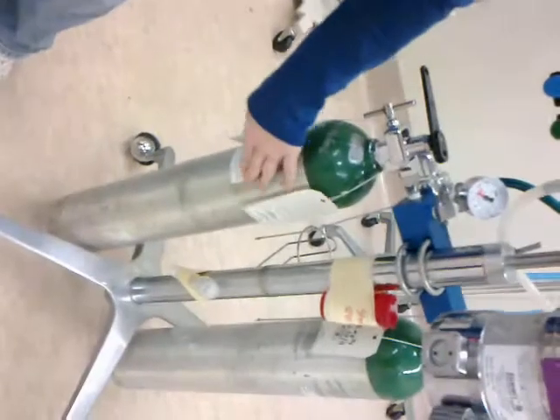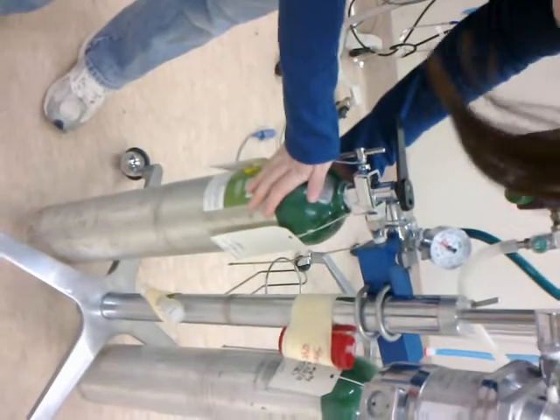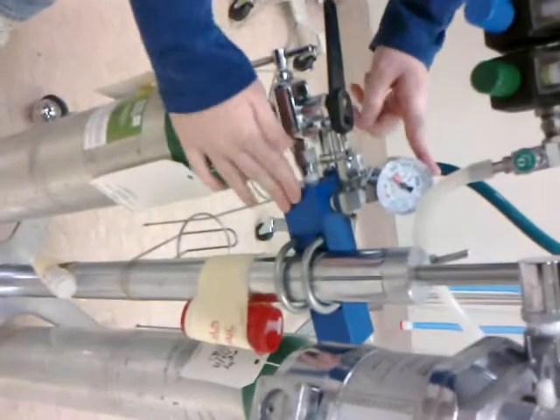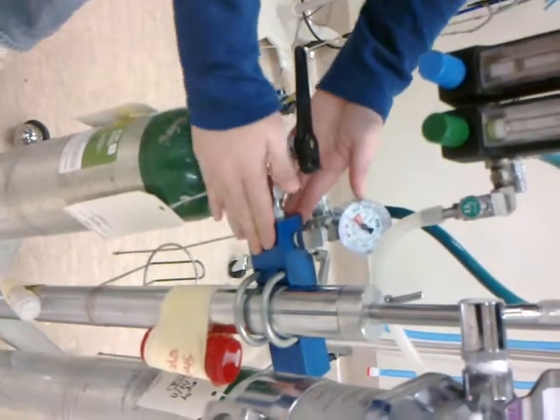The oxygen source is an E-tank. We also have E-tanks over there, but for our purposes we're going to use the E-tank. Here's the oxygen pressure gauge and the yoke. We have to make sure that the tank is connected to the yoke.